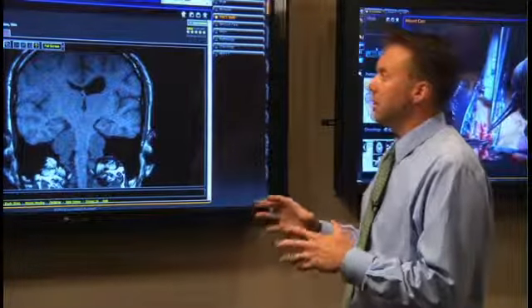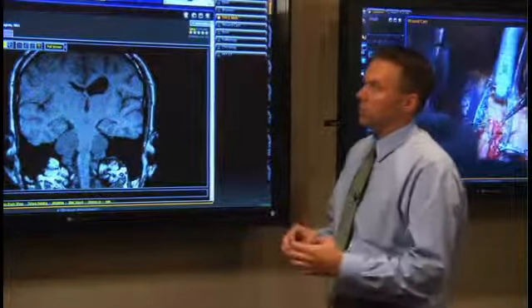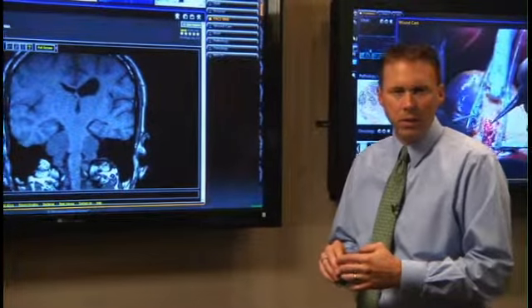Those are two very simple, automatically solved problems with the ControlOR platform due to the scalability and the flexibility that we have.